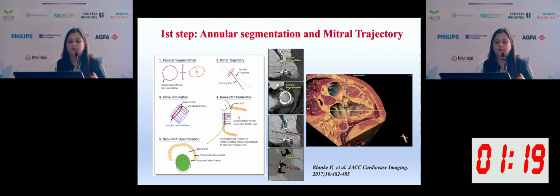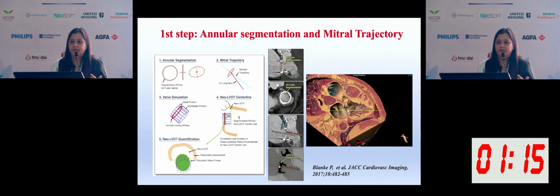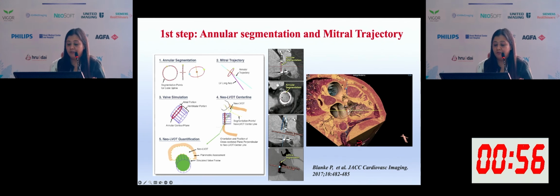As mentioned, this software is very important in terms of mitral valve-in-valve assessment as well. So it goes in a similar manner as mitral. I will just be repeating it briefly. Same as native mitral valve, you identify the annular segment. So basically, you will identify the ring instead of the native annulus. The ring is identified in a similar manner as you do in the aortic valve-in-valve.